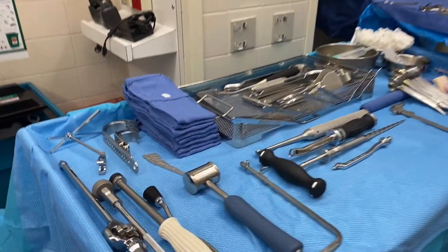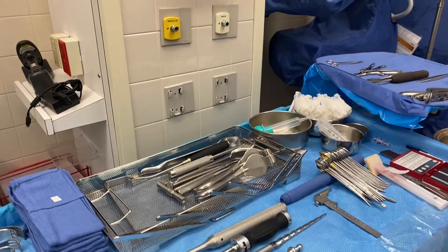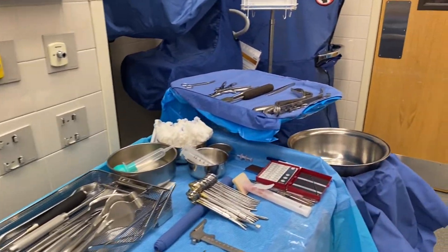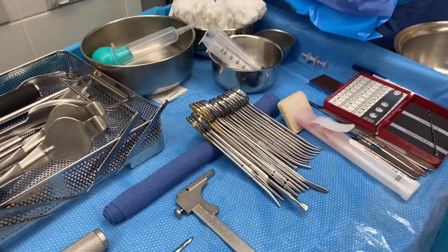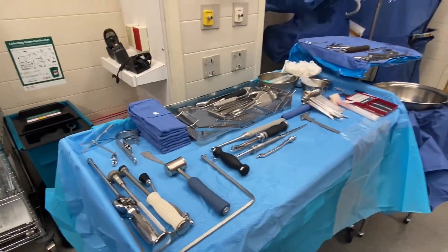We had a cancellectomy on a hip procedure, so I figured this was a perfect opportunity to just go through the instruments and kind of show you guys some stuff real quick. Let's get started.